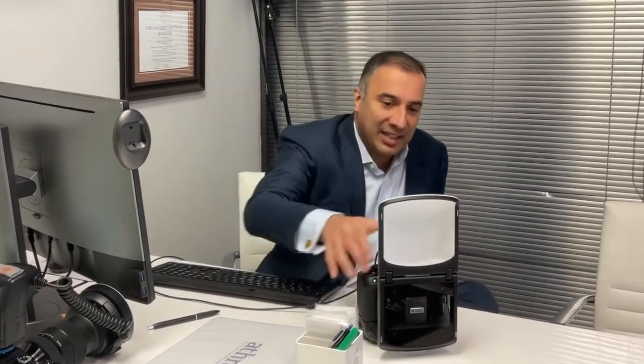One of the surgeries I love doing the most is rhinoplasty, and for rhinoplasty specifically, computer imaging and all these types of things are super important. Over Christmas I bought myself a new gift — a 3D imaging processor which allows us to really look at the face in 3D, look at things like angles and volumes.